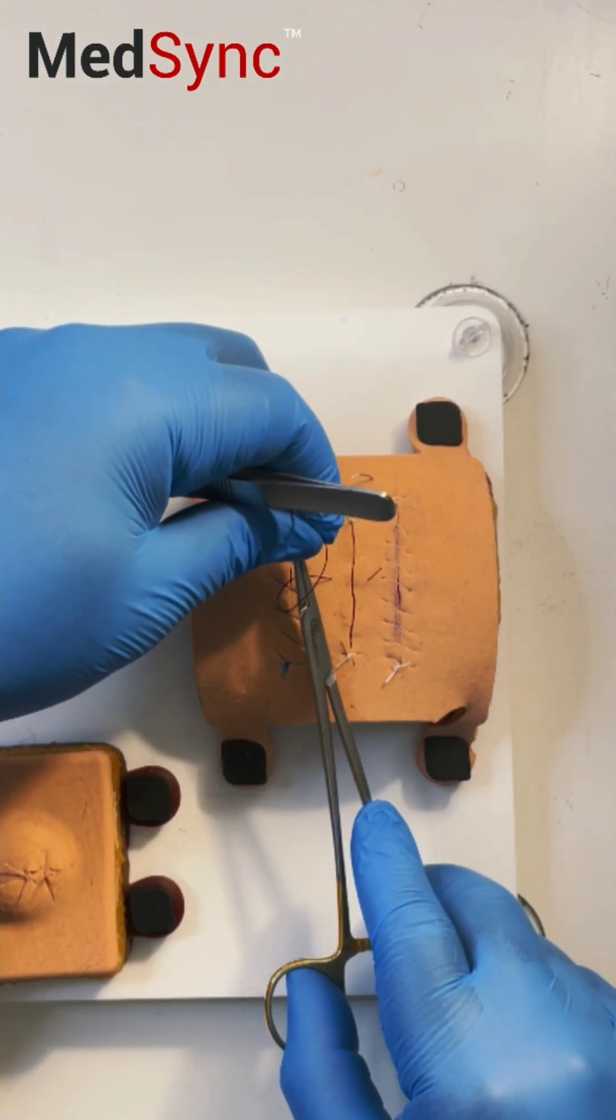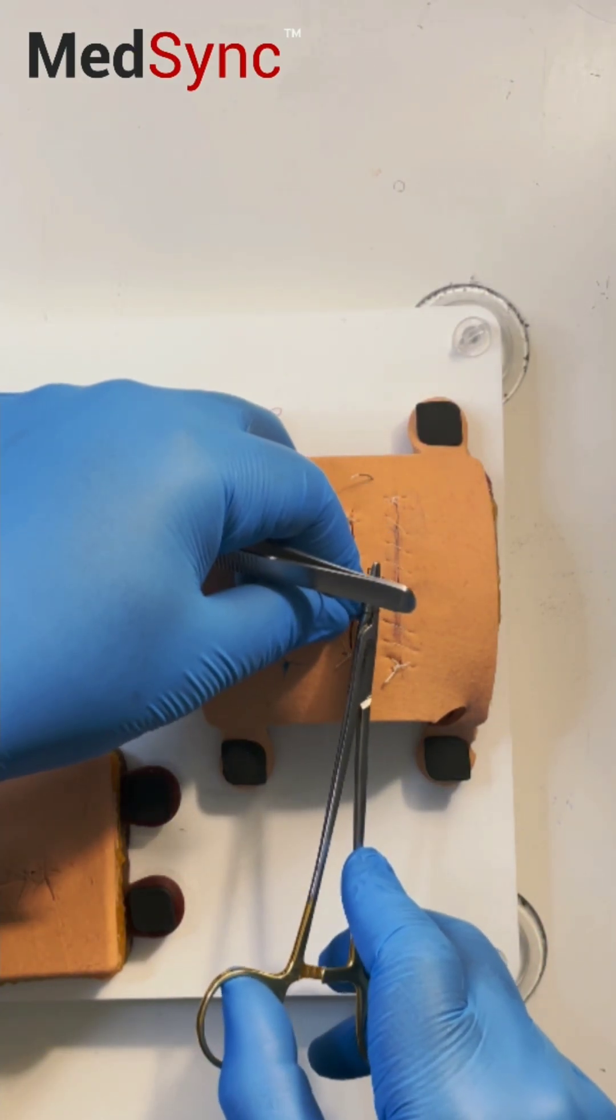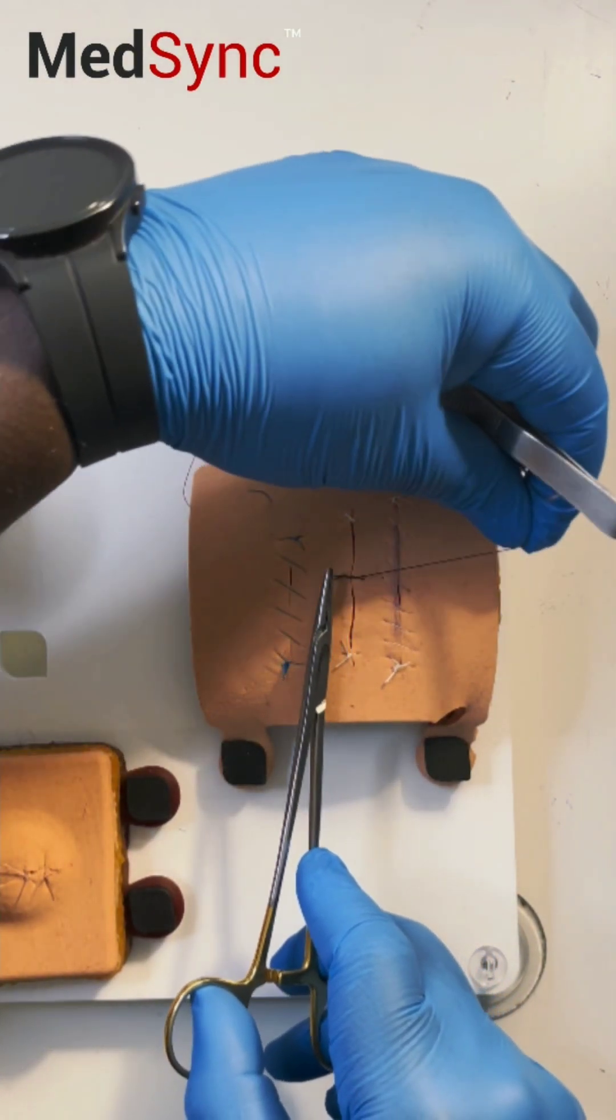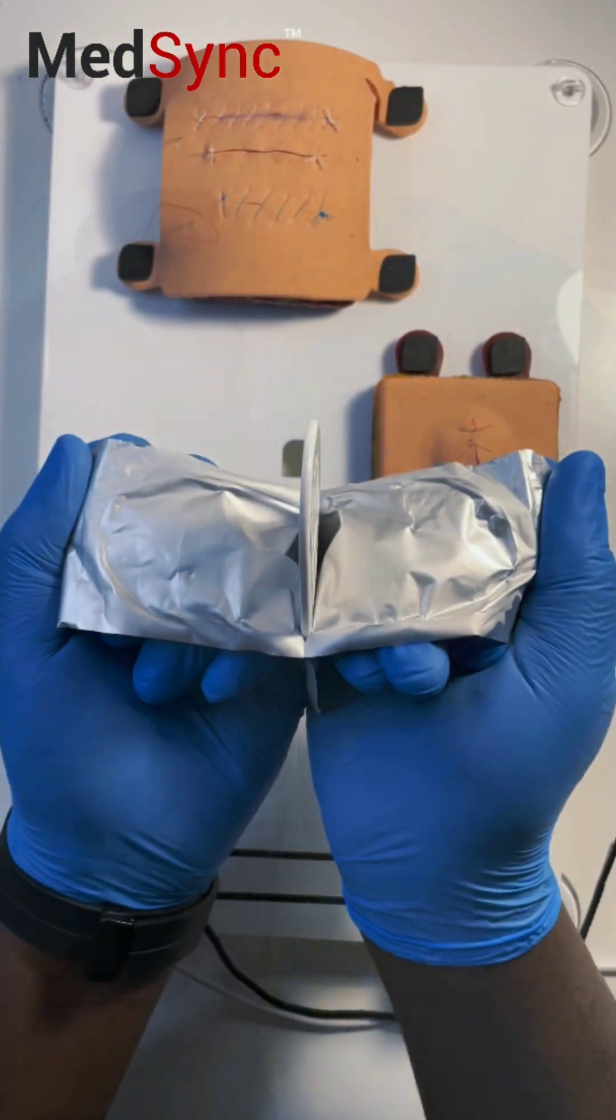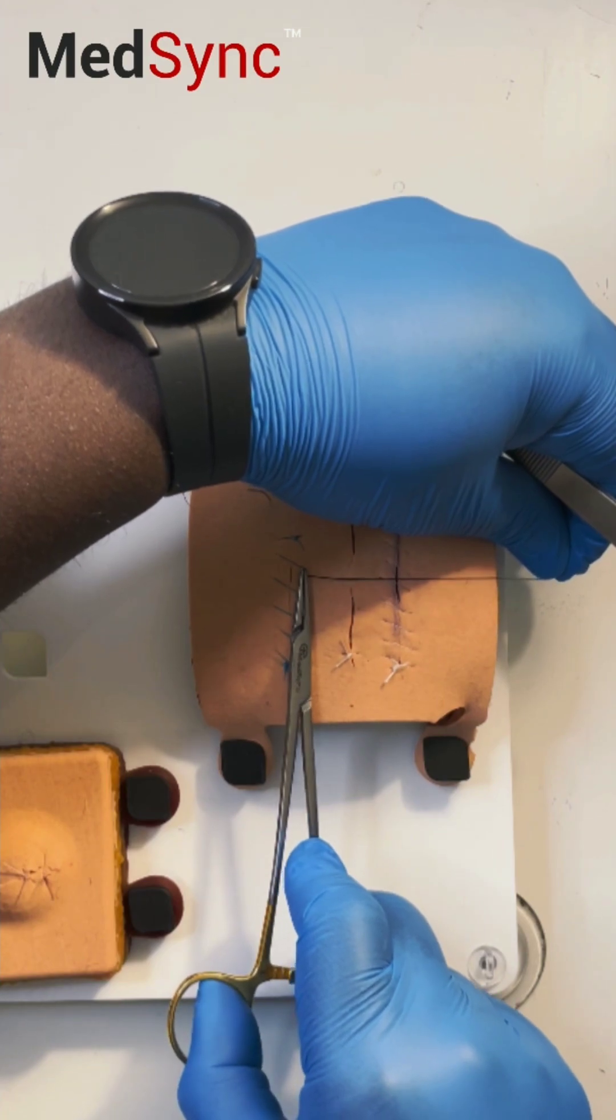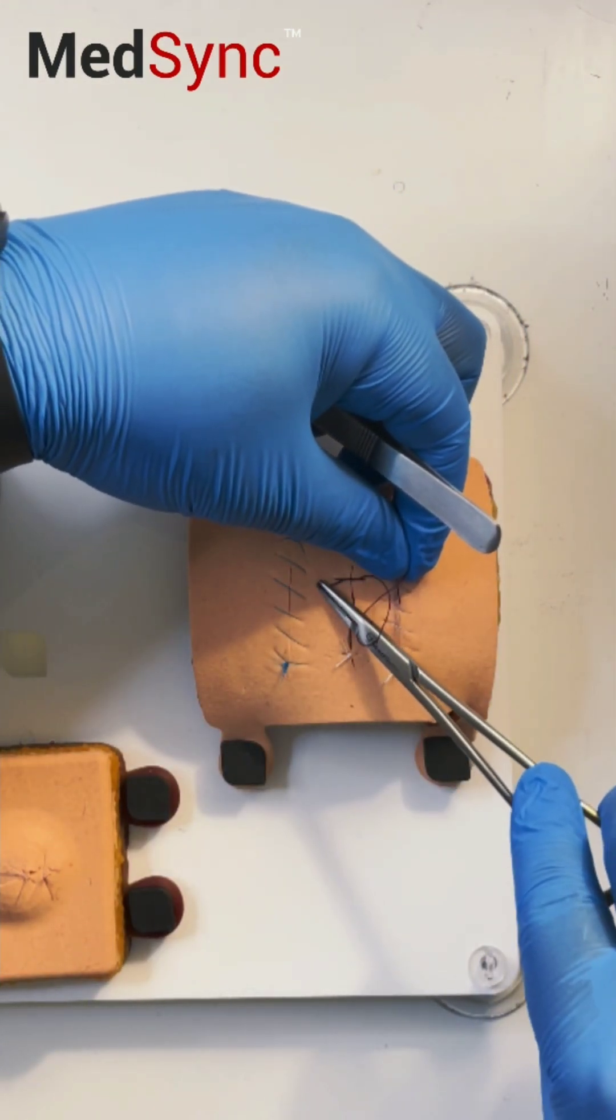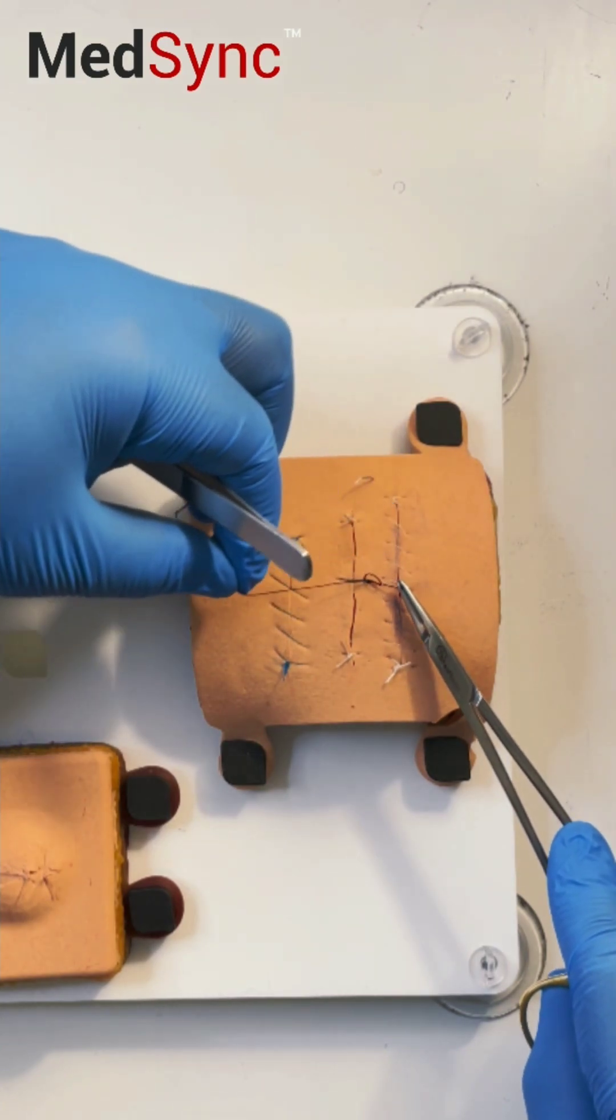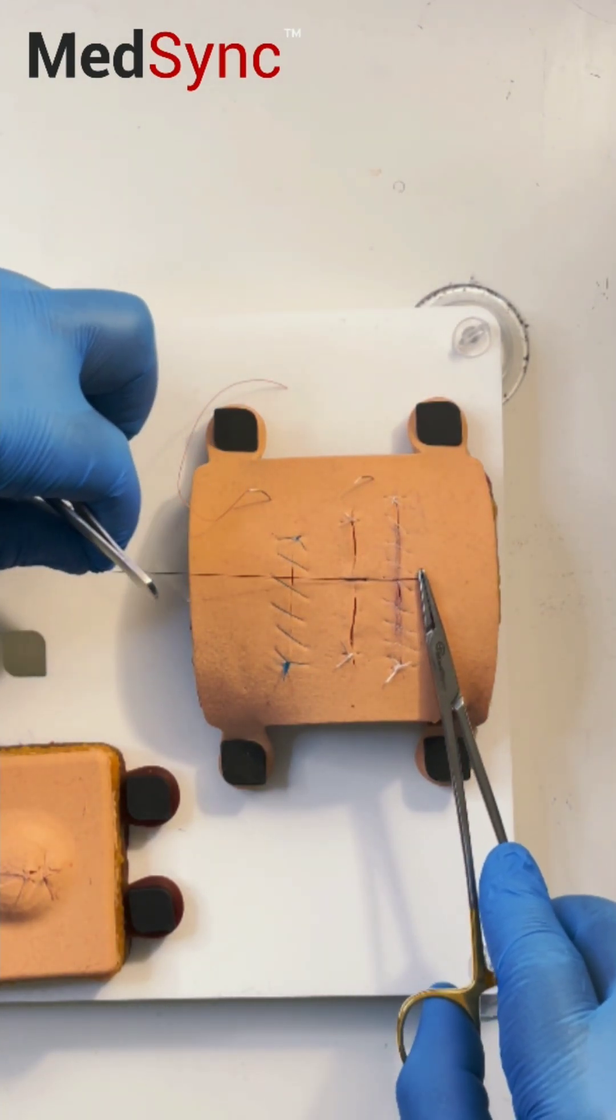Wrap the suture around the tips of the needle holder and lay the suture knot perpendicular, or at 90 degrees, to the wound itself. Now repeat the same steps: wrap it around the tip, pull the short end through the loop, and alternate the position of the long and short thread one more time.